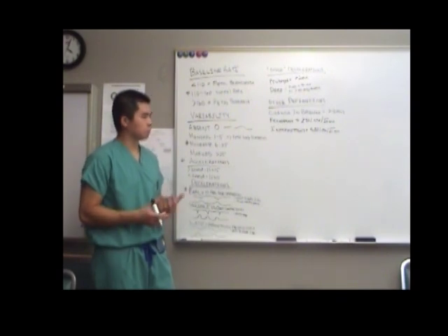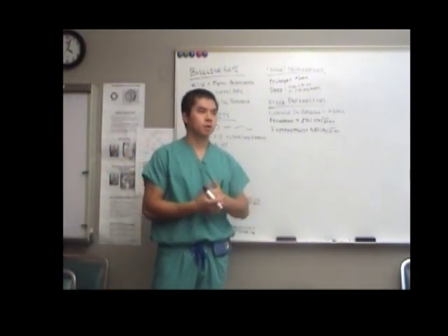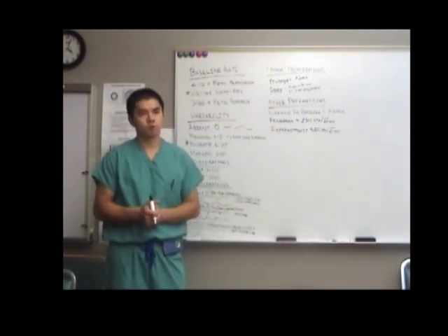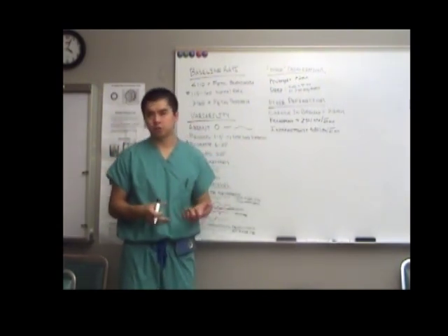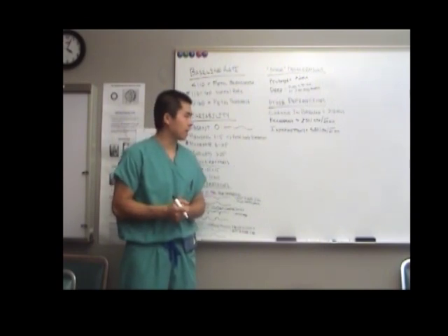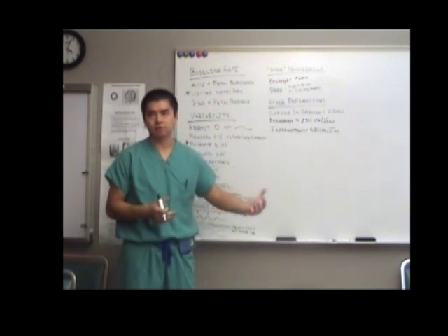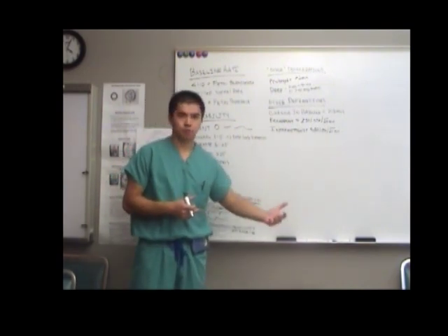Now you might run into a situation where you get 3 contractions in a row and you get 3 lates in a row. Now you wouldn't wait around for a whole 20 minutes to see whether or not it's truly recurrent or intermittent. You could be a little more descriptive and say, well, we've had 3 late decelerations with the last 3 contractions, or you can say they've been recurrent with the last 3 contractions.